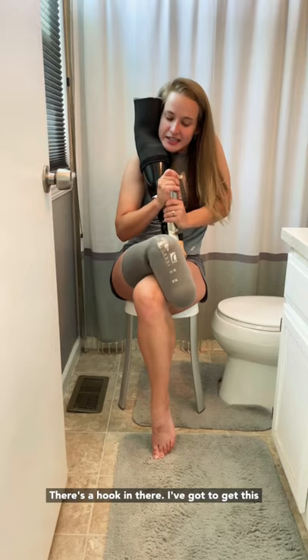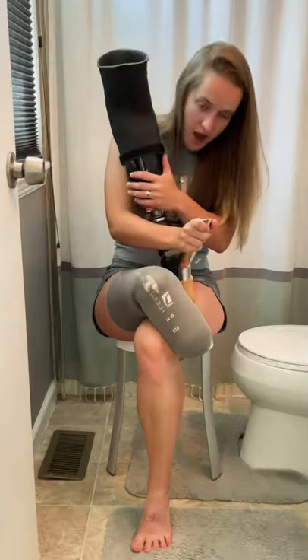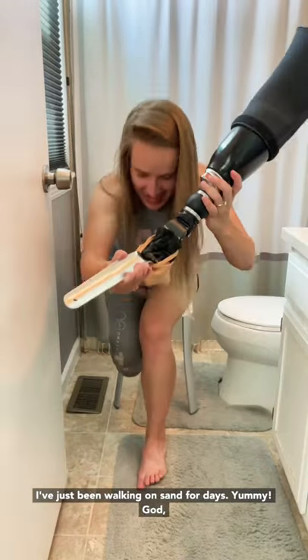There's a hook in there. I've got to get this blown out. If anyone knows a better way to do this — I've just been walking on sand for days.